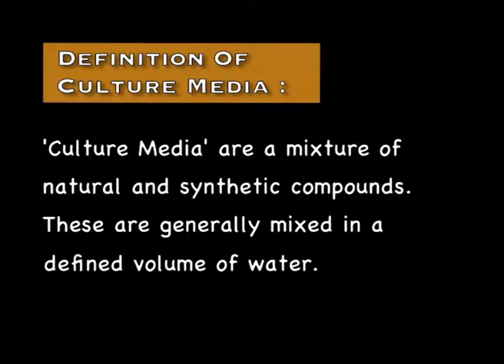Now, generally the culture medium serves plenty of functions. So let us again first see what is the definition. The definition, as I told you earlier, is a mixture of natural and synthetic compounds. Now, the natural and synthetic compounds are generally mixed in a defined volume of water. If it is liquid culture, then the type of your growth medium will be different.